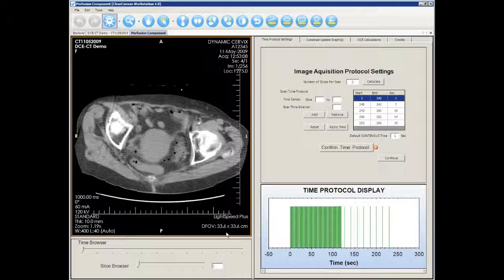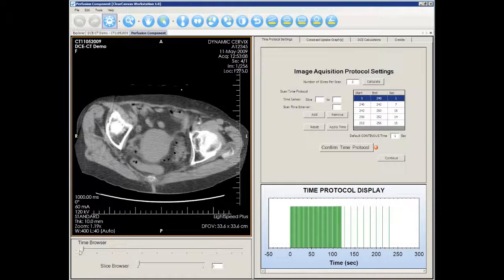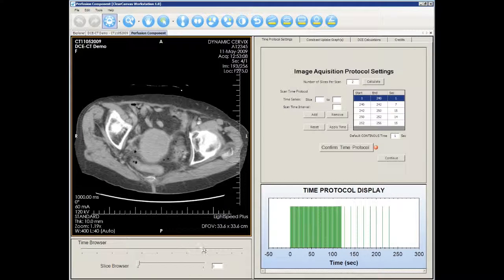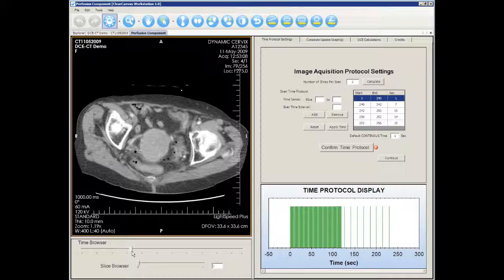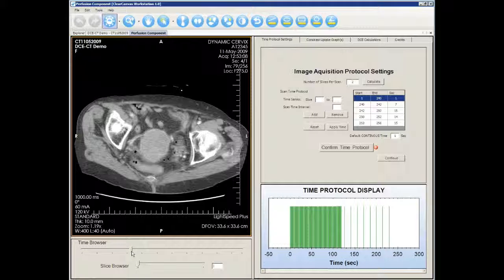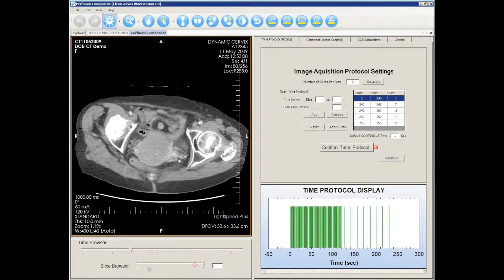Use the time browser to visualize the contrast uptake at any one slice through time, or use the slice browser to visualize the different slices.